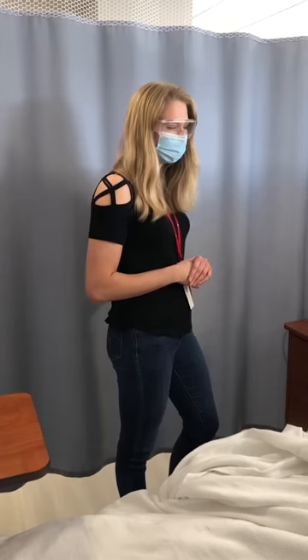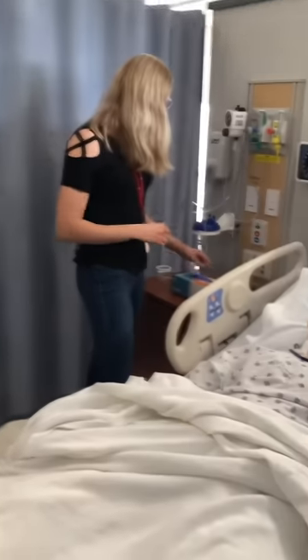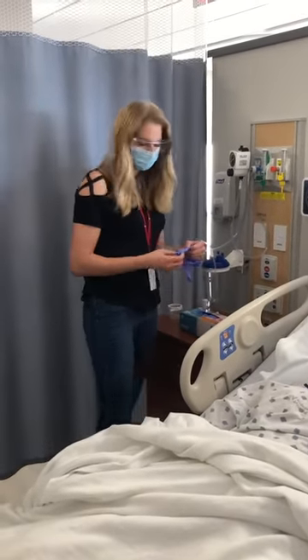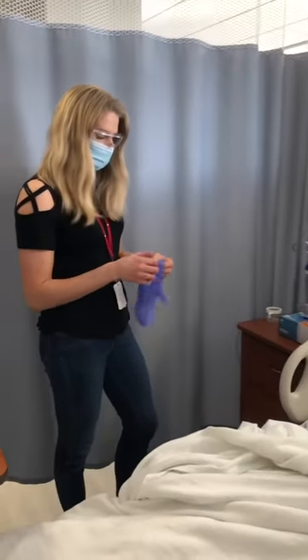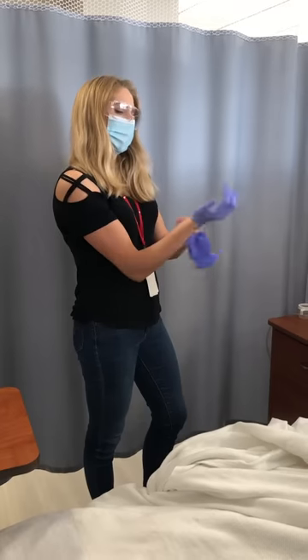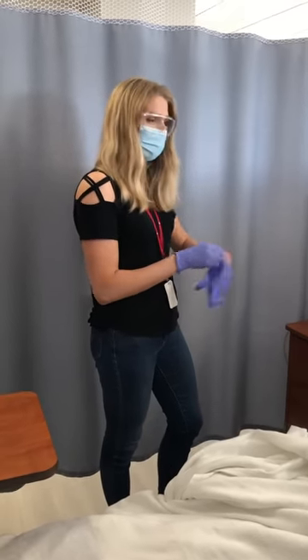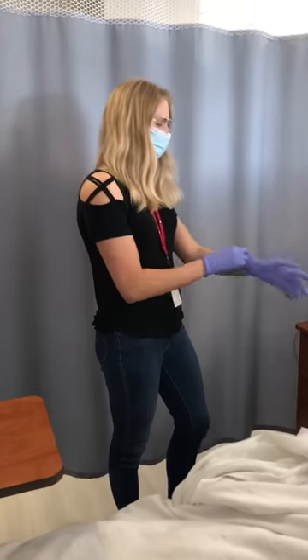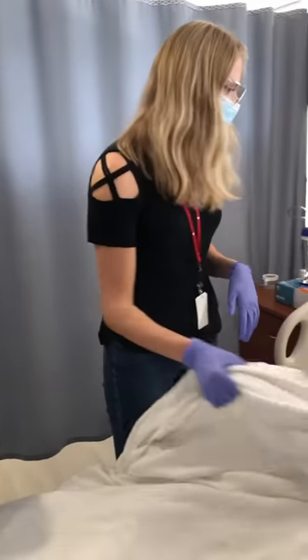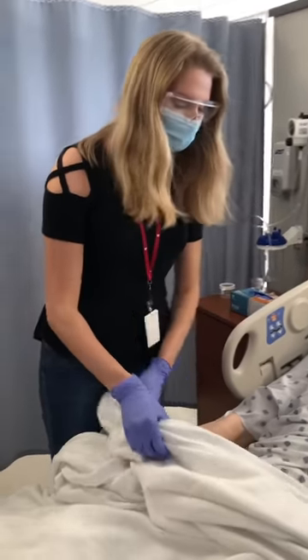Before I start, I would like to know: do you have an allergy to latex or shellfish? Not that I know of. Okay, that's good. Because some of the products we're going to be using, such as the catheter that we're going to be inserting, we have to be concerned about if you have an allergy to those things. I think we're good to go. Awesome.